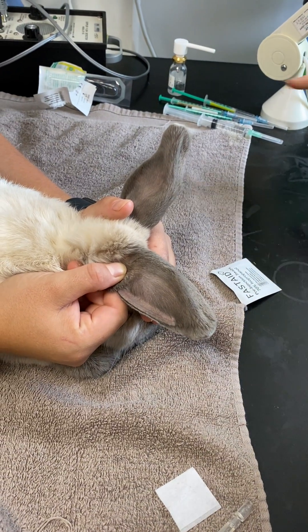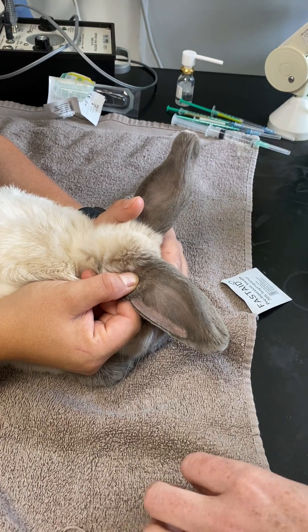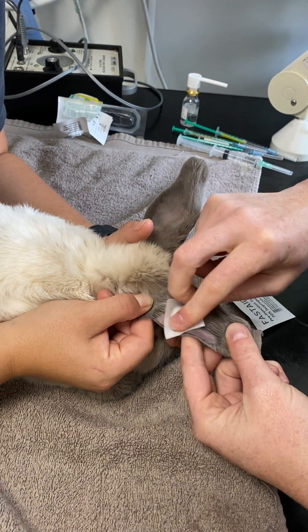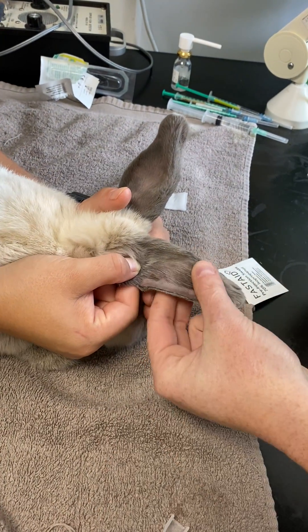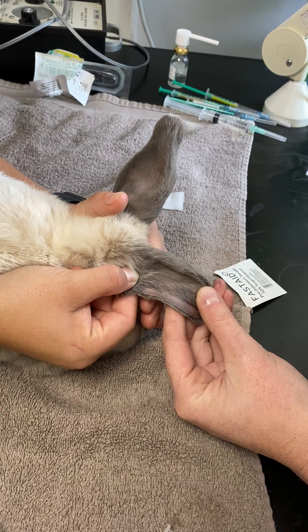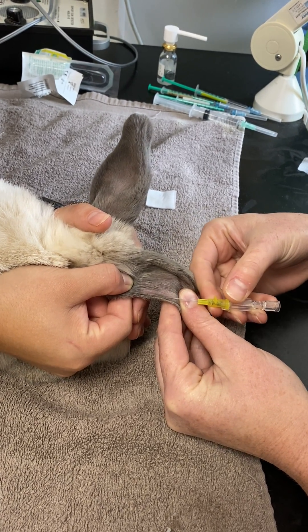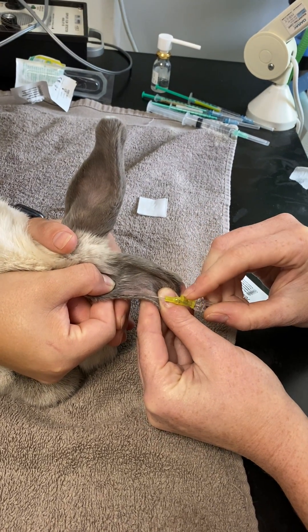Today we are going to show you how to tape in a rabbit IV cannula. A lot of people tend to put lots of tape around it and lots of things in their ear, but we find that makes them really uncomfortable and they're more likely to pull it out. So we've clipped and EMLA'd this rabbit's ear and we're going to place an IV cannula into the lateral ear vein.